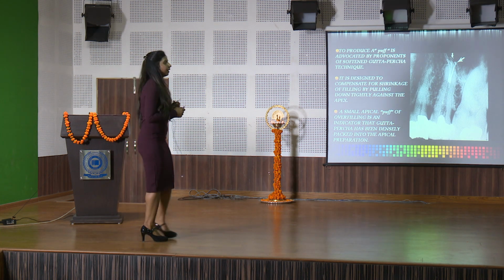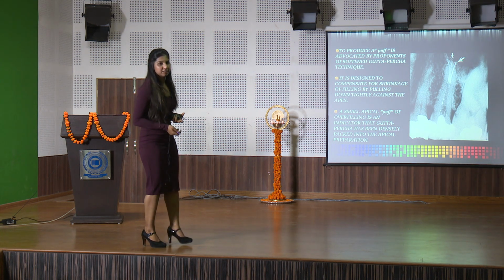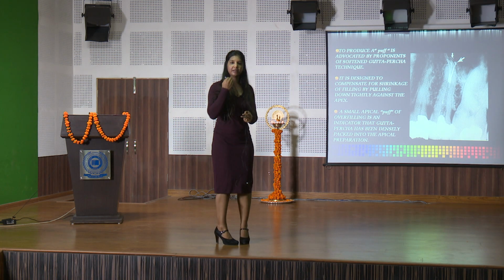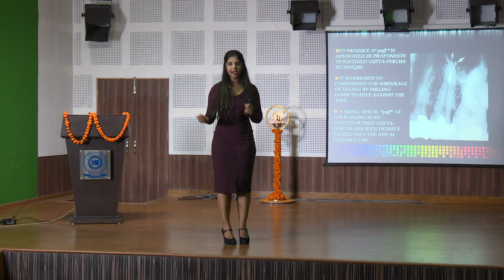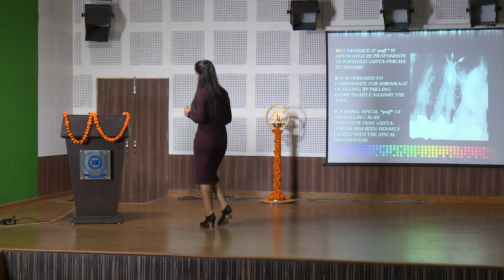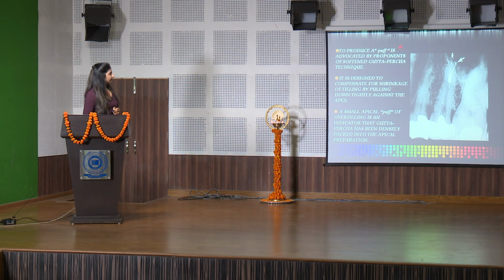But if you want to create apical puffs with normal cases where you're using a single cone technique or lateral condensation technique, you are doing no good, but rather you are making the patient feel uncomfortable for a couple of days, because no matter which sealer you use, until and unless it is set, it will remain toxic. Although the periapex will resolve with time, it is better to do puffs only in cases of softened gutta percha.